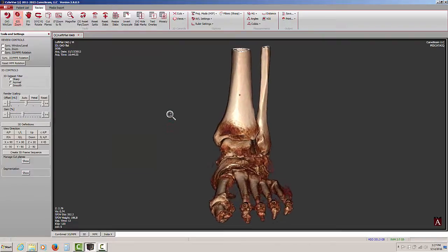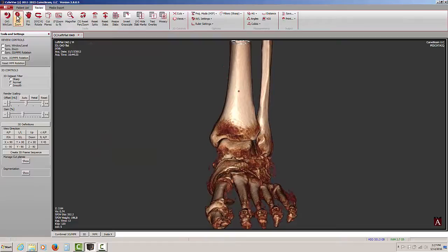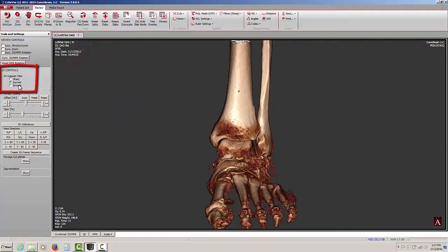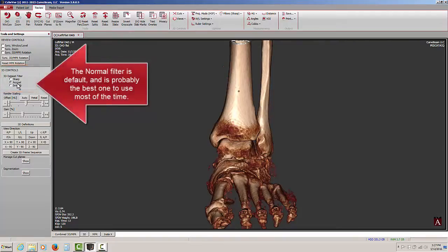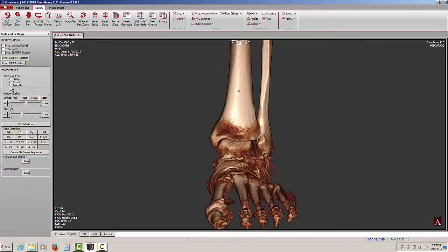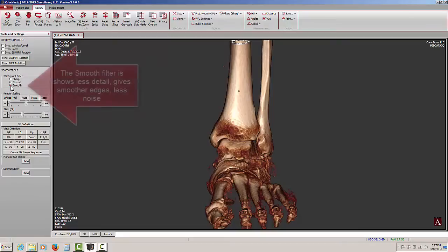Another control I have available under 3D controls is the 3D dataset filter. By default, it's set on normal and that's probably the best place to keep it. But depending on if you have a clean scan or not, you might want to experiment with either smooth or sharp filters.